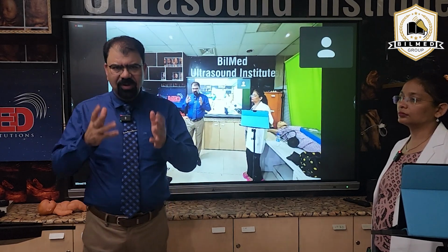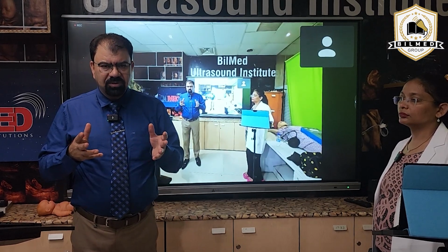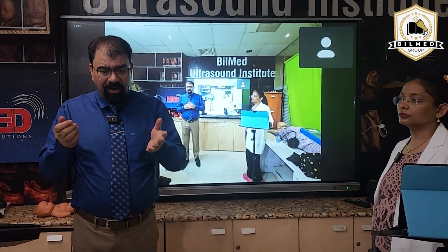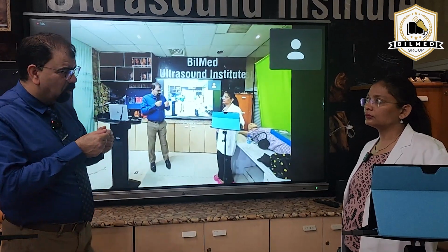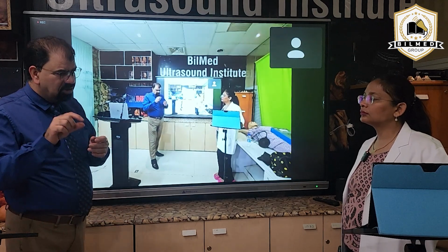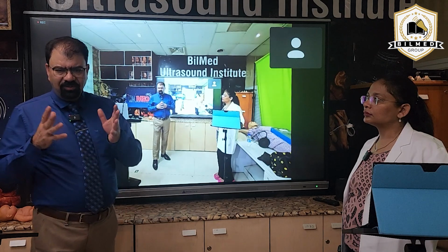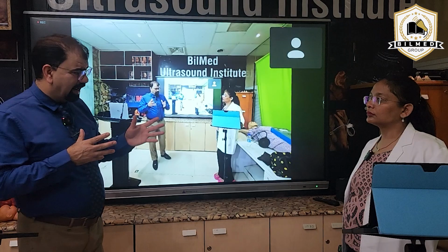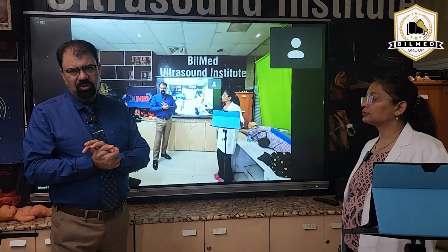And once your eyes catch this, if it is obliterated or absent, then you will say, oh my God, there can be chances of spina bifida. Then why not insert a probe over here and try to get the spine? Because when you are inserting a probe, you are getting a better picture of the fetus, and you will see that there is actually a spina bifida. And I pray to God that if there is spina bifida in that patient, you pick it as early as possible and send the case to me, and I will be more than happy to see that.